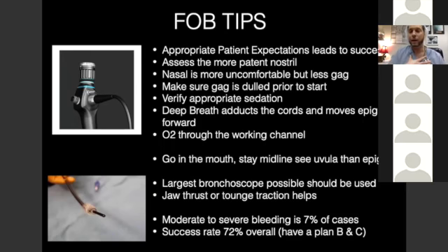But me at a community hospital today, if I get to the emergency pathway, there's nobody else to call. I'm doing, let's say, a urology case, it's 2 a.m. I need surgical airway access. I'm doing it. And the way to do it is to feel the thyroid cartilage, put a knife on, enter the cricothyroid membrane, stick a Kelly in, spread it, and put a 5 tube in. Or for me, I would use the Melker cricothyrotomy tray because we're good at central lines. The Melker cricothyrotomy tray is just like putting a central line in.